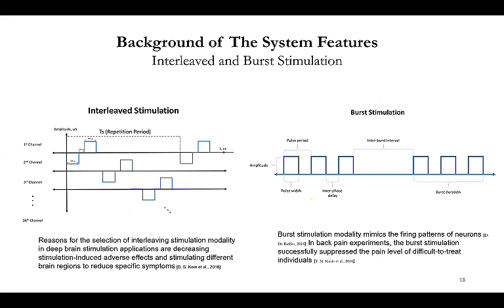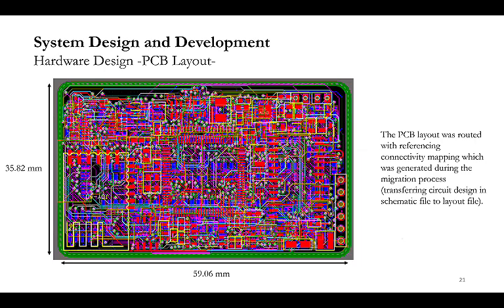So our idea is shrinking as much as possible. Because of the size constraint, we have to use only small components, so the design has to be small. Because of that, it is complex and expensive. I see. That's why it's quite different from other electronics, which usually use a two-layer design. It's very dense, the design that you have here. Exactly.